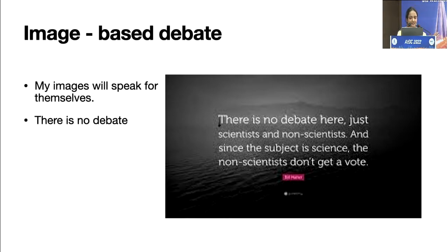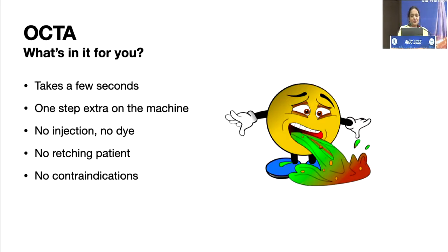There is no debate here, just scientists and non-scientists, and since the subject is science, the non-scientists don't get to vote. So what's in it for you? It just takes a few extra seconds. It's just there on the machine, same machine, one step extra, no injection, no dye, no retching patient and other patients getting scared about what is happening to him, and there are no contraindications.